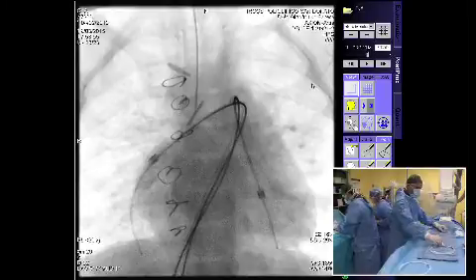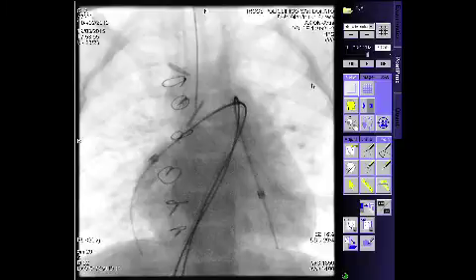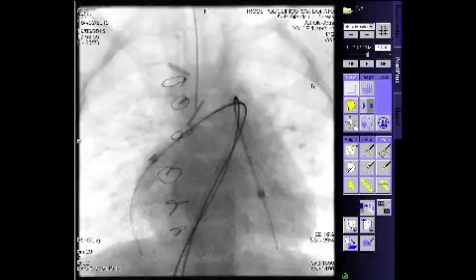What would the alternative sizes be? I mean, for those who don't know the stents, what other sizes exist? The other sizes are 6 and 10. The lengths are 618 and 626 for the 6, while the 8 comes in 818 and 826, and the 10 are available at the length of 17 and 26. The 10 goes through a 7 French sheath.